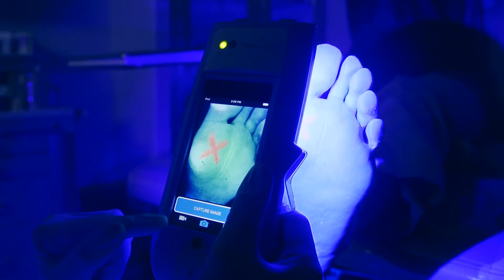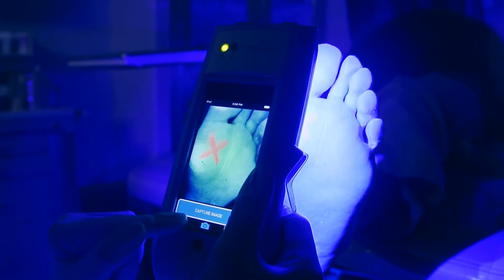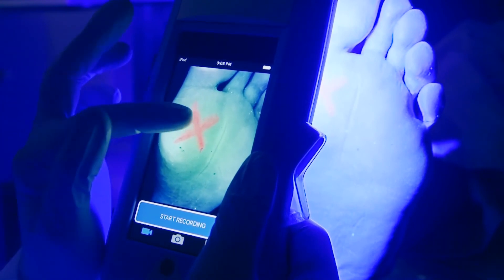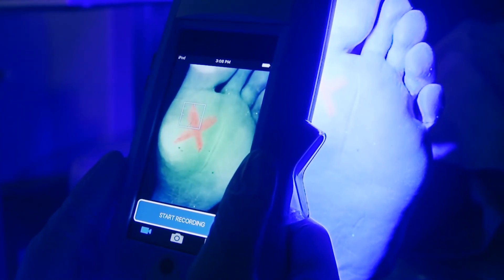Or if you want a video, press the video icon in the app. Then tap the screen to obtain focus, and then press start recording.